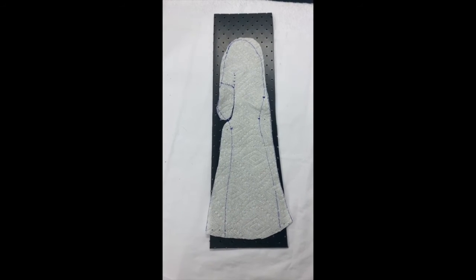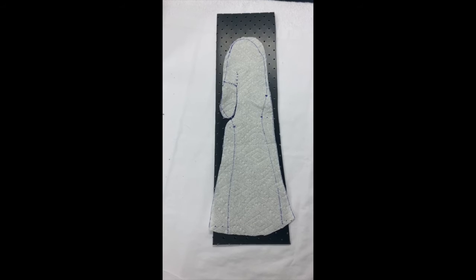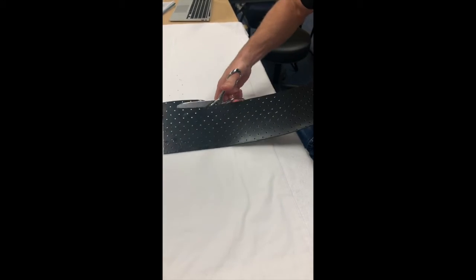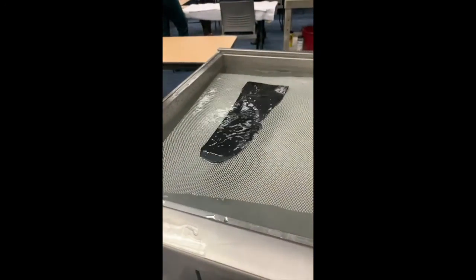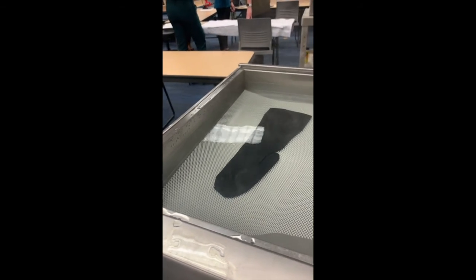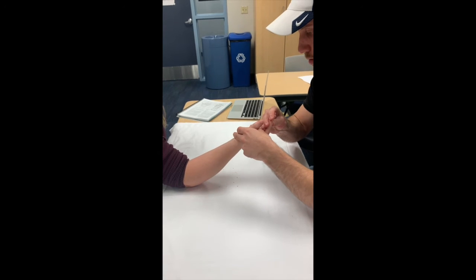The thermoplastic material that we chose has characteristics of 1/8 thickness to keep the joints from reverting towards extension, memory for frequent adjustments, moderate conformability, and moderate elasticity. Once the pattern is cut, place it back into the splint pan to activate it before molding. In the meantime, position the client in the anti-deformity position or intrinsic plus before molding the orthosis.